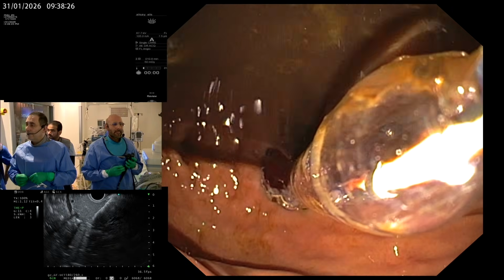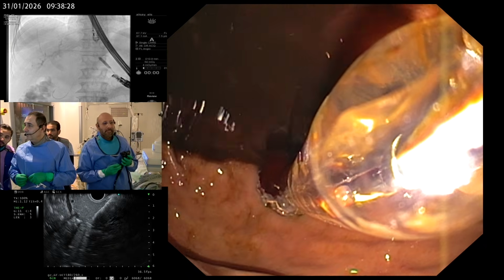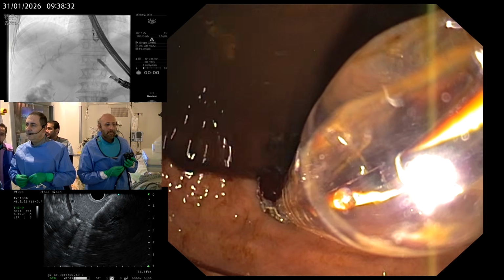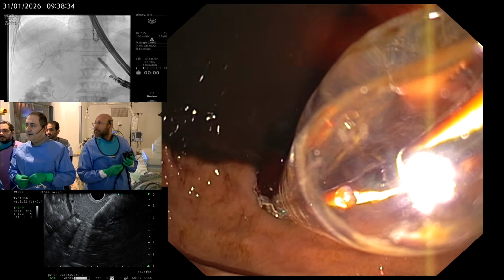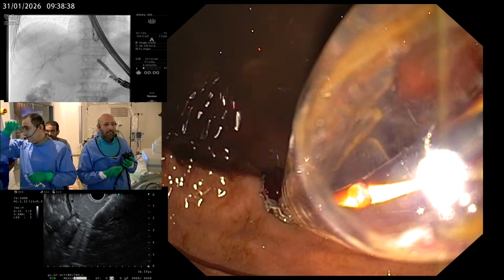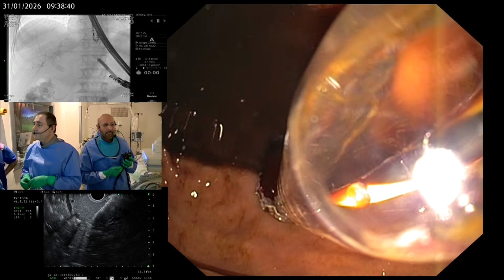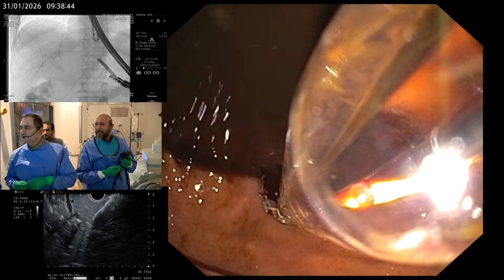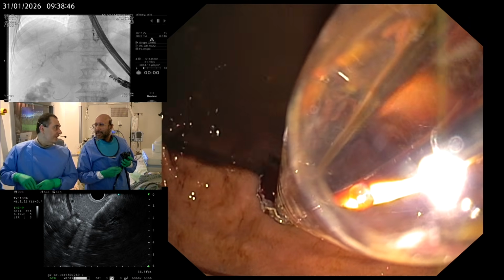Pass the wire. It's already passed. I know. Dilate. Keep dilating. Okay, this is good. Balloon down. You're going to have to go deeper. Voilà. Okay. Balloon down.